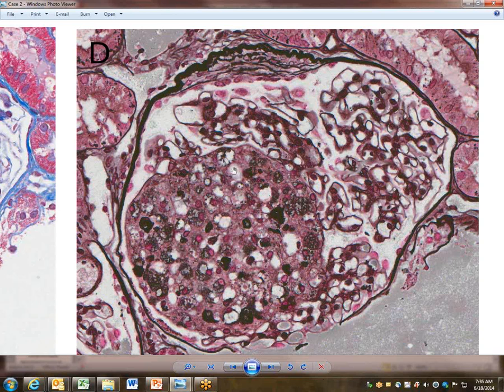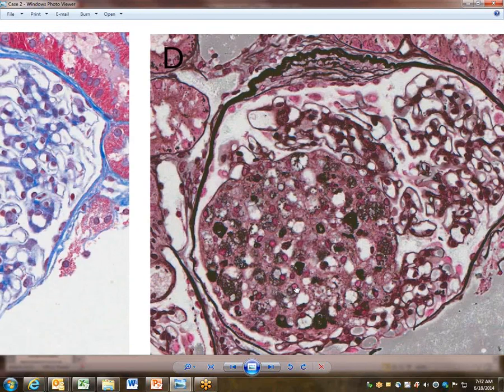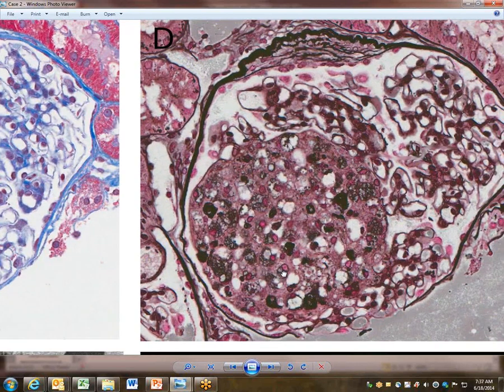Some of them look like just holes, as opposed to, now this looks like it might pass for a capillary lumen entrapped in this, but I have a harder time with that one or that one, or a couple of these. On an individual one after another basis, you get into some ifs, ands, and maybes that you can't really tell, I think. But otherwise, smooth, regular contour. Yep.